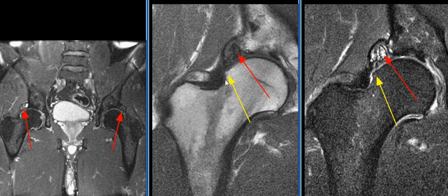The femoral head is aspherical and shows minimal fibrocystic change in the anterior aspect of the femoral head-neck junction, consistent with femoral acetabular impingement.